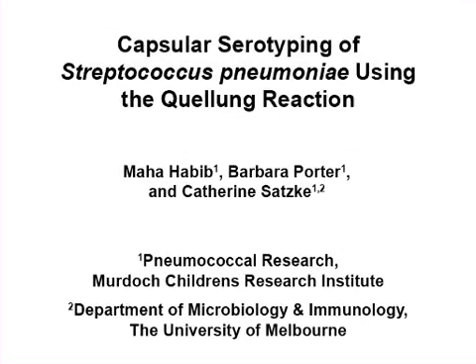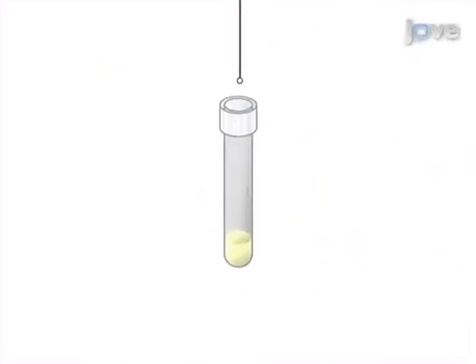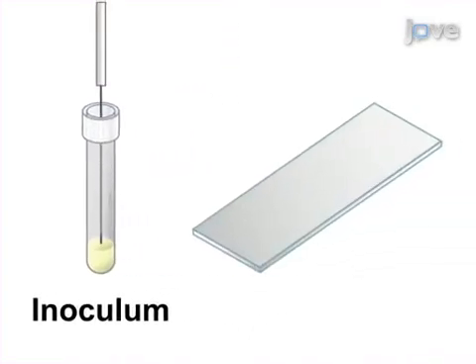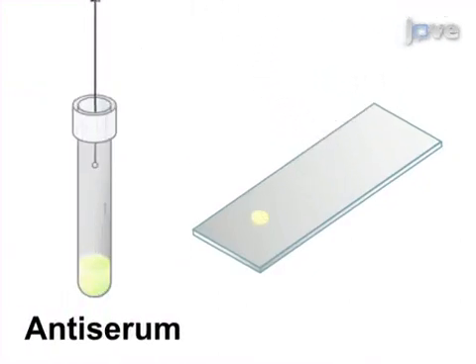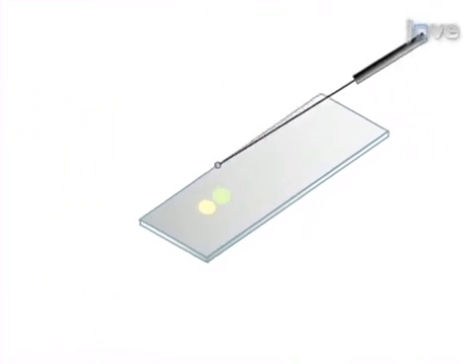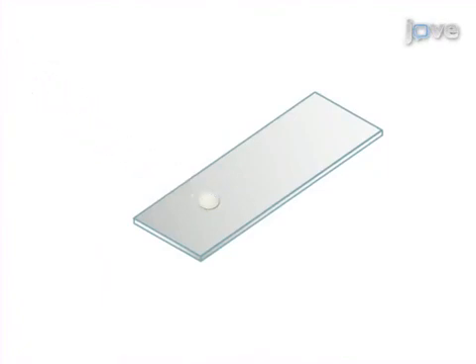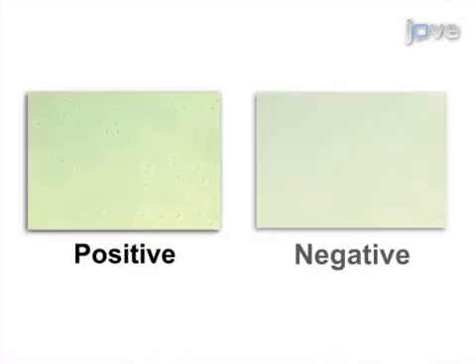The overall goal of this procedure is to perform capsular serotyping of Streptococcus pneumoniae, or the pneumococcus, using the Quellung reaction. This is accomplished by first inoculating a heart infusion broth with a fresh overnight pure culture of pneumococci. In the second step, a drop of inoculum is transferred to a glass microscope slide. Next, anti-serum is added in equal volume onto the slide. In the final step, both drops are mixed and a cover slip is placed over the suspension. Ultimately, the suspension can be viewed under phase contrast to observe the positive or negative Quellung reaction.